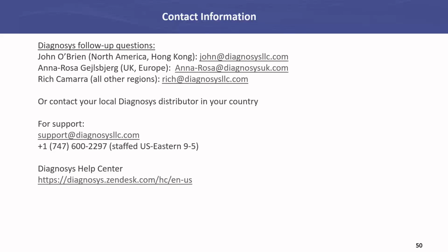We recently updated our manual, I think last week, to include some additional references for and advice on positioning and placement of, among other things, the pattern ERG stimulator. So if you shoot an email to support@diagnosysllc.com and say, I hear you have Rev D of the manual, can I have an updated Celeris manual? I'd be happy to send you one.